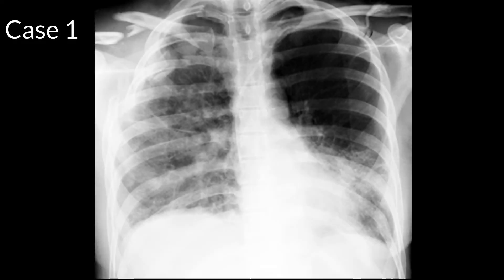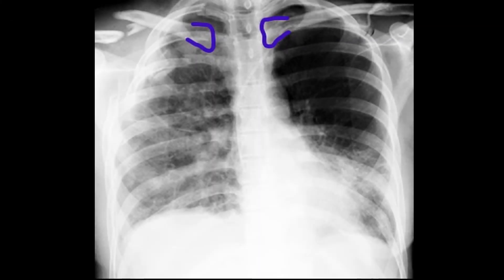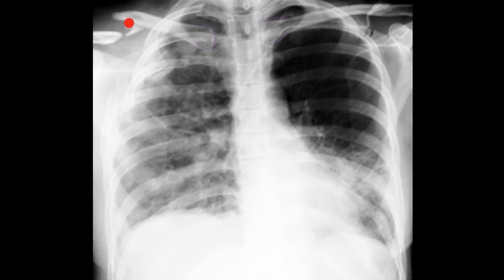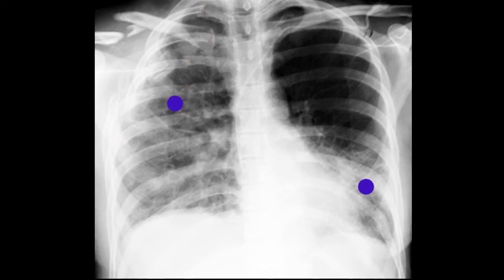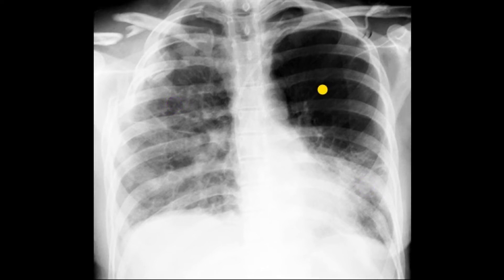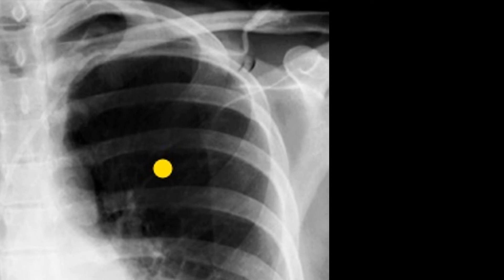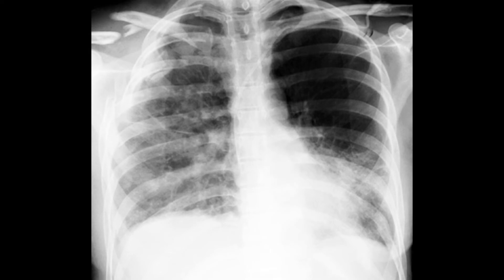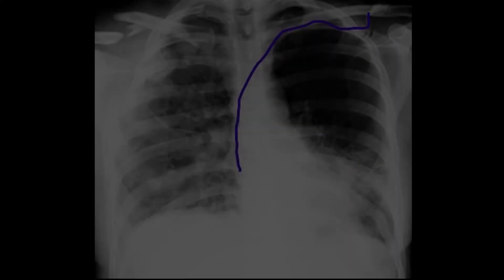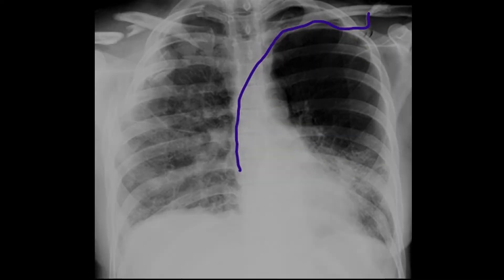Case one — looks like a fair bit happening here. Starting with A, adequacy: it is a bit rotated, but penetration's okay and I can see all the lungs bilaterally. B, bones: there's a fractured clavicle, fractured ribs posteriorly — at least four, maybe five. The scapulae and vertebrae look okay. L, lungs: increased whiteness diffusely on the right-hand side and also the left base — probably some contusion, maybe a bit of hemothorax. It looks a bit black at the top on the left — I was wondering about a pneumothorax, but I can't see one. Soft tissue: no air in the soft tissues. Software: there's a central line, subclavian, on the left-hand side.